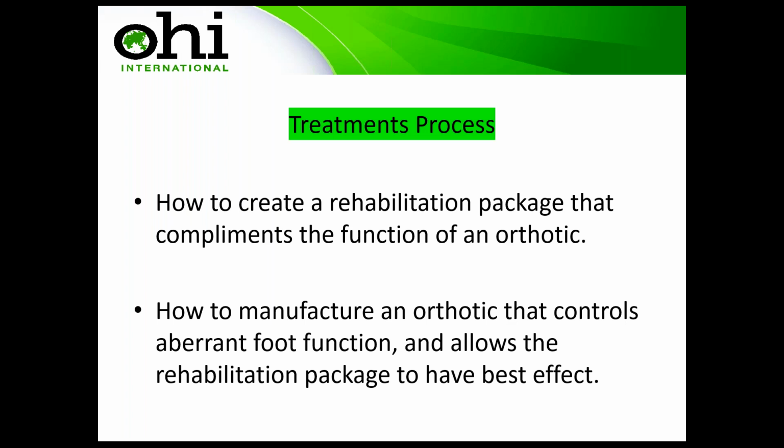It's a marketing tool that costs nothing, and people will then start asking you, do you do the scan? The second thing for the treatment process is how to manufacture an orthotic that controls aberrant foot function and allows the rehabilitation package to have its best effect. There is no point in having a rehabilitation package to stretch out the IT band and to work on your calf flexibility and then allow the foot just to collapse and then have to twist 7,000, 10,000 times a day.